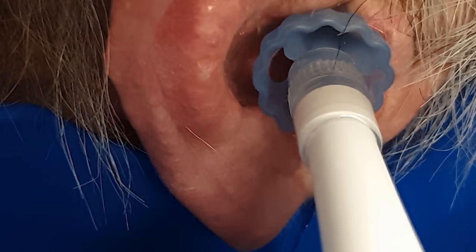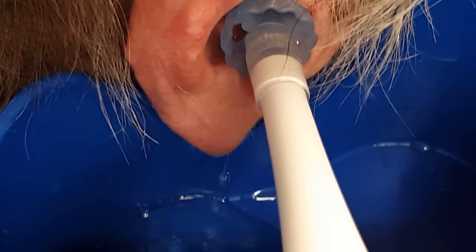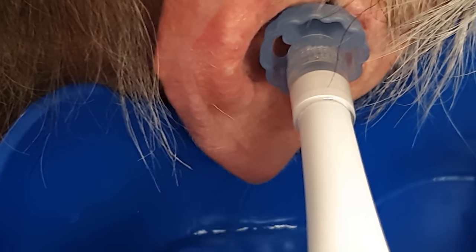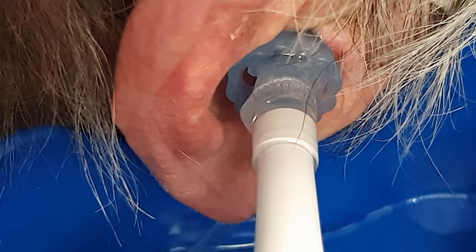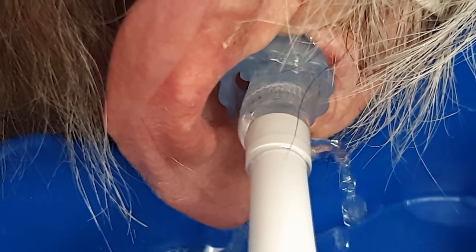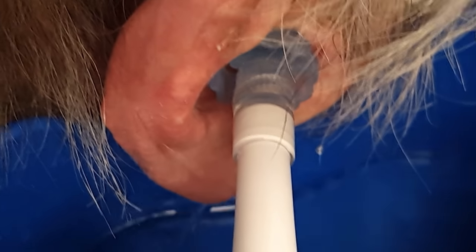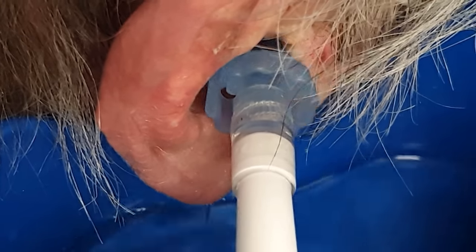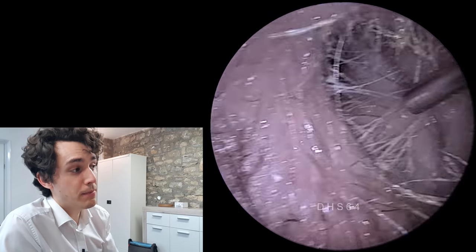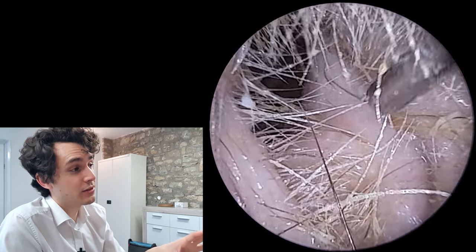I will show you how this irrigator works at the end. It almost looks like a bit of a novelty — it is basically just a squirty bottle, but highly effective. You may be wondering why I don't showcase this equipment more often or why it's never usually seen across audiology or earwax removal channels. That's primarily because suction is better, quicker, and safer. It just so happens that this is one of the rare cases where, for safety reasons, I would have to defer to another method. With a manual irrigator like this, which is very low pressure, the chances of perforating the eardrum are virtually impossible.